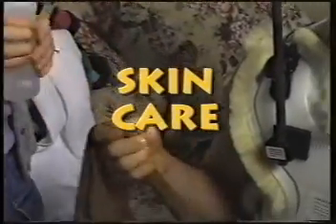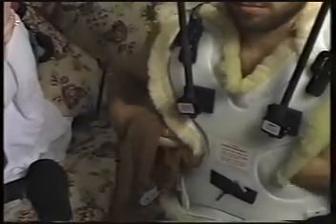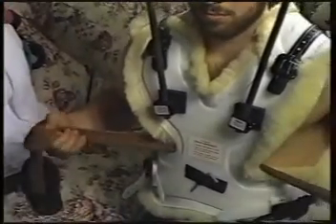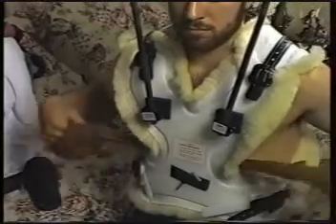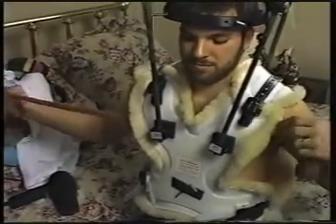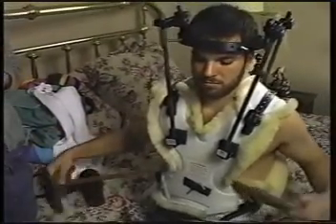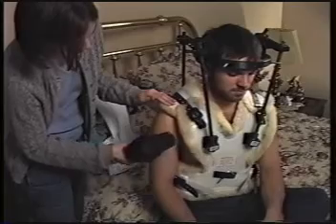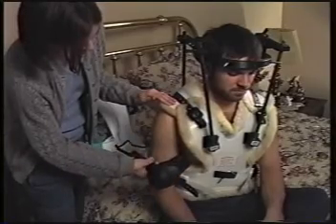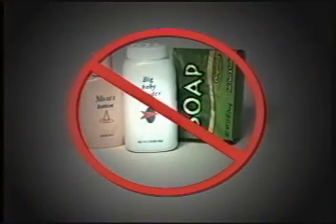Taking care of your skin under the vest is important. Wipe your skin under the front and back of the vest every day, keeping the liner as dry as possible. Pantyhose makes a good cloth because you can get underneath the vest, and it is also the best thing to use if you itch under your vest. Wipe your skin to dry it and use a blow dryer on the cool setting to dry any extra moisture. Do not use powder, lotion, or soap because they could irritate your skin.